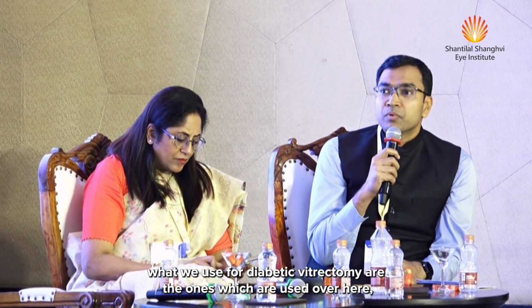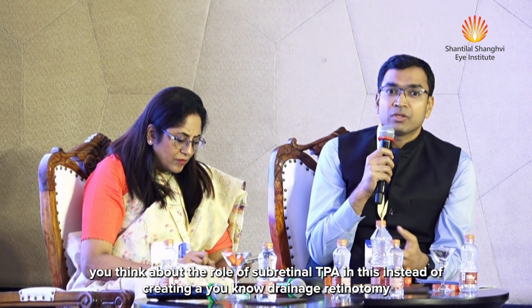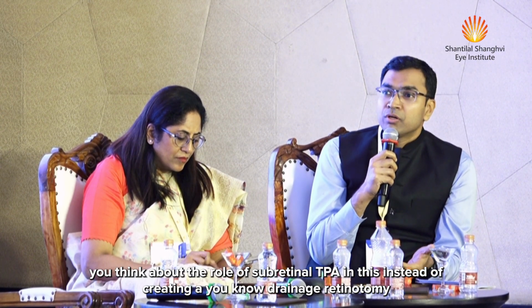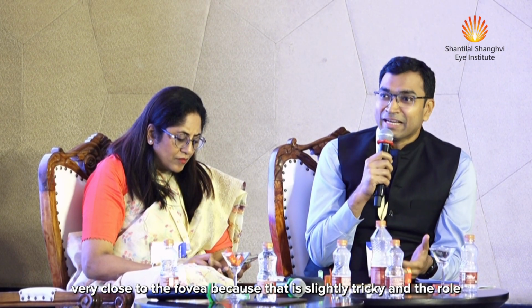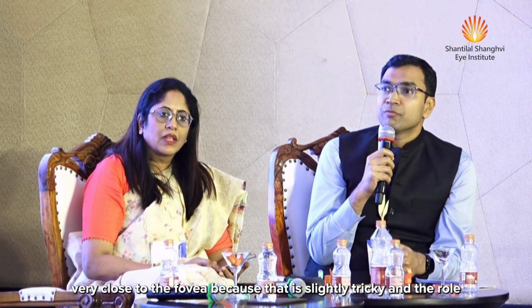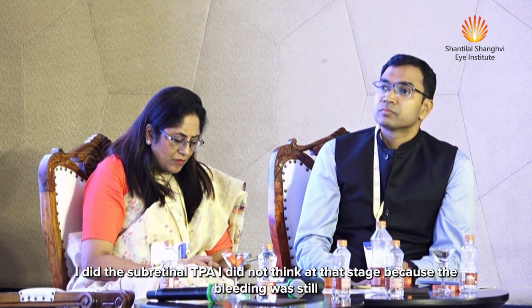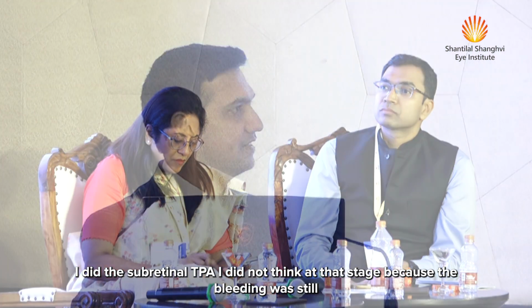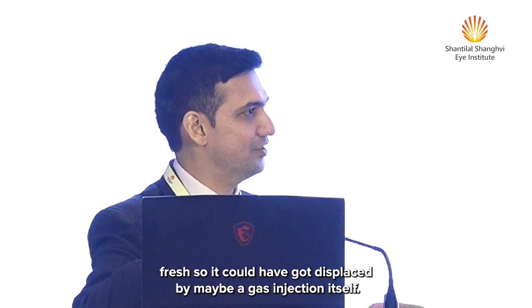Beautifully done case, surgery, Jay. What do you think about the role of subretinal TPA in this, instead of creating a drainage retinotomy very close to the fovea, because that is slightly tricky, and the role of PFCL probably? I did not do the subretinal TPA at that stage because the bleeding was still fresh, so it could have got displaced by maybe a gas injection itself.